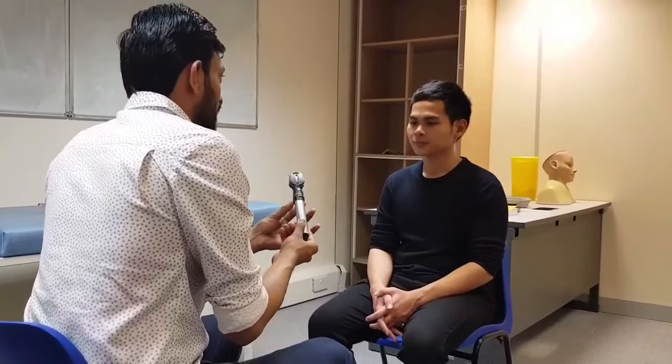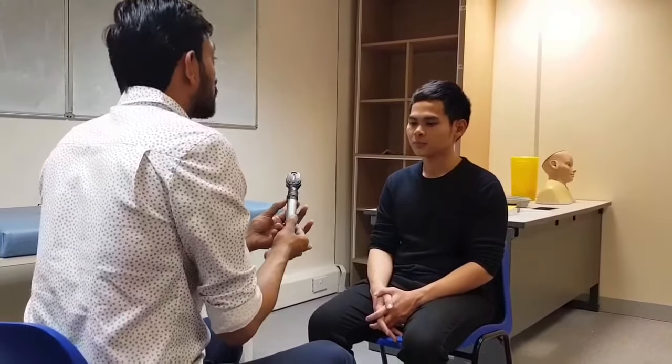I'll be examining your eyes with the help of this instrument. This is an ophthalmoscope. I'll be shining a bright light in your eyes — you might feel a bit uncomfortable. Please bear with me.